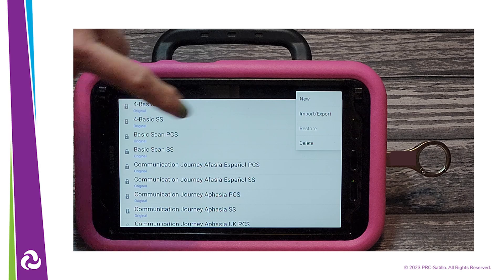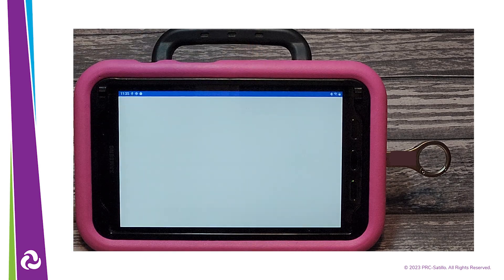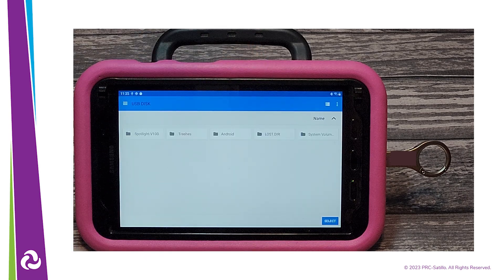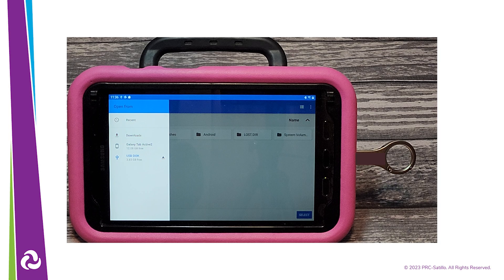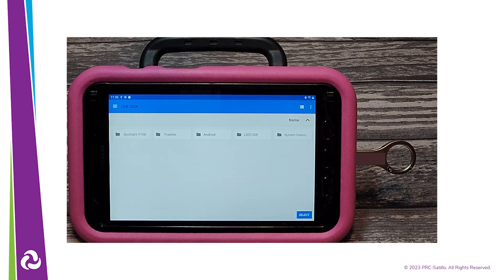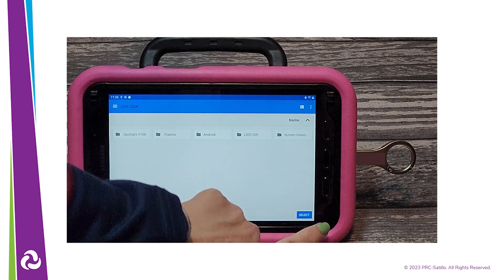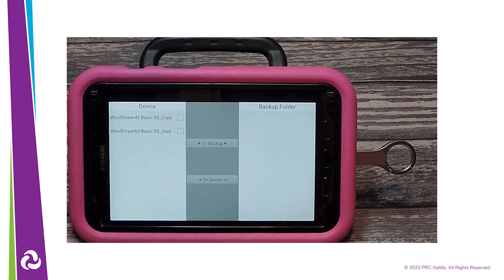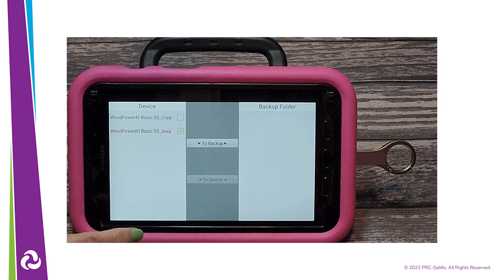Select Import-Export. The next screen may look different on different models of NovoChat. Tap on the three lines in the upper left corner and make sure that USB disk is selected, then tap on the Select button. Copied vocabulary files on the device will be on the left side of the screen, while files on the dual USB will be on the right side.